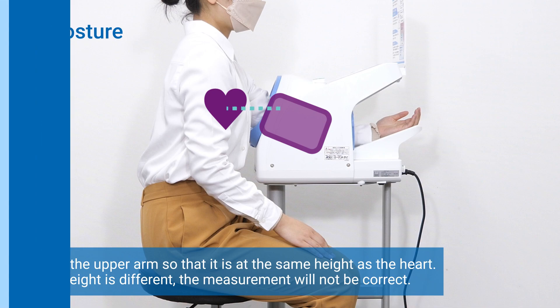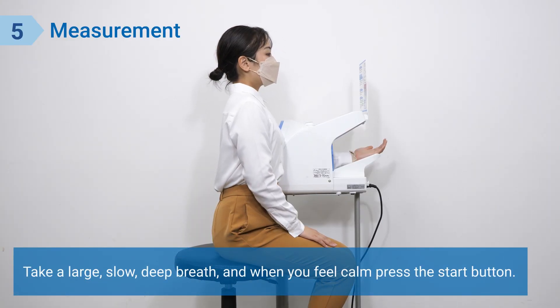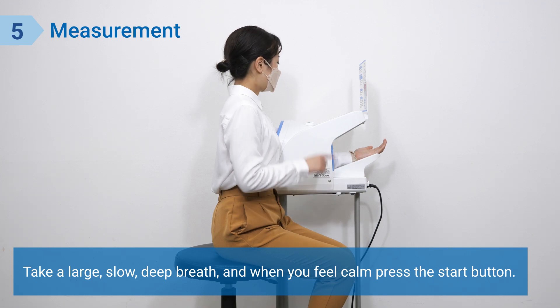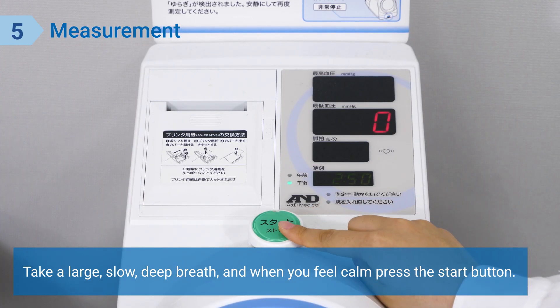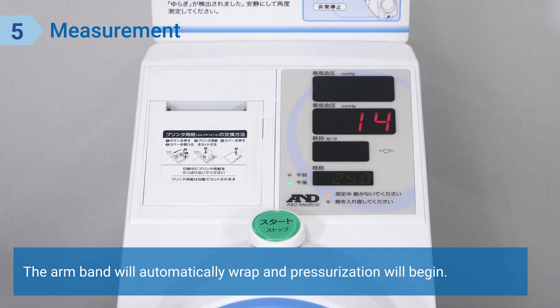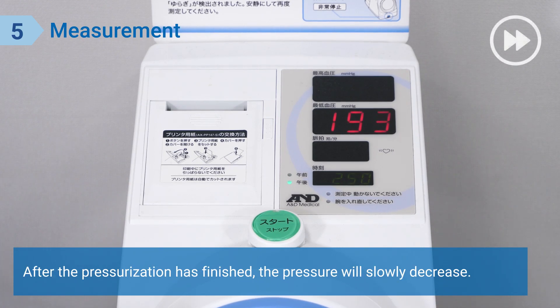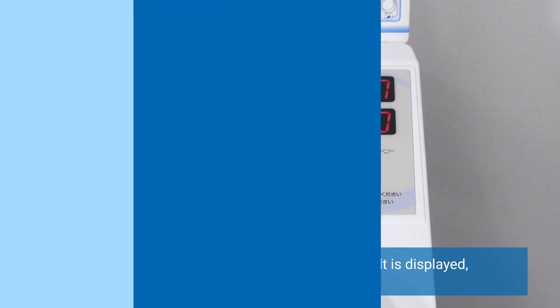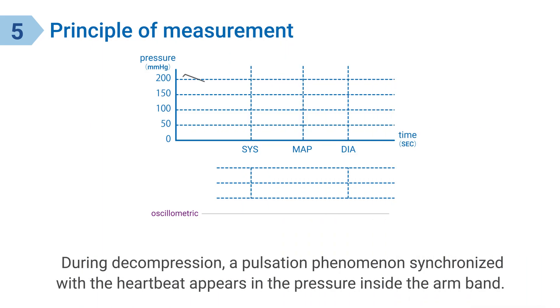Take a large, slow, deep breath, and when you feel calm, press the start button. The arm band will automatically wrap and pressurization will begin. After the pressurization has finished, the pressure will slowly decrease. Once the arm band releases and the measurement result is displayed, the measurement is complete.